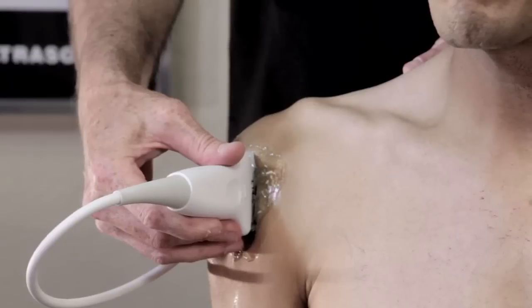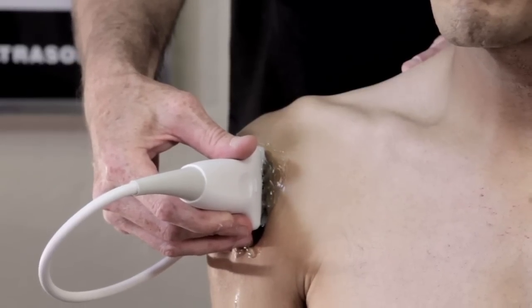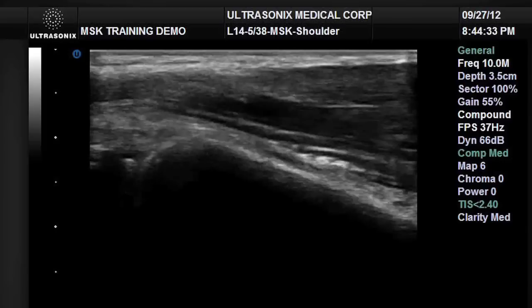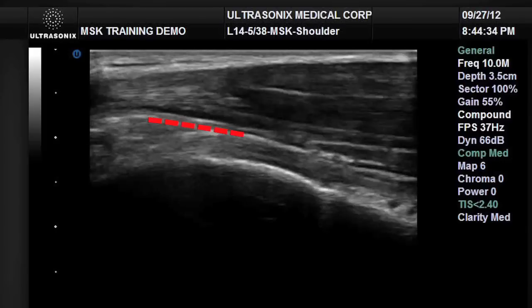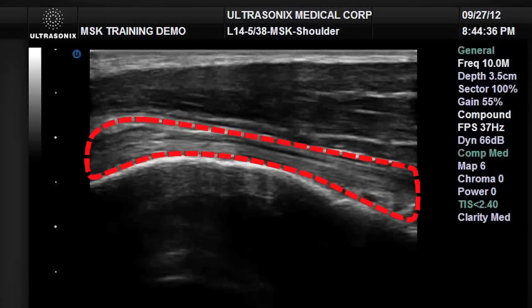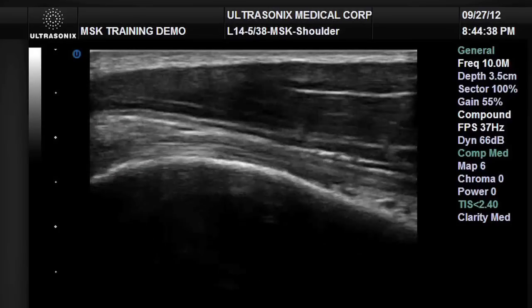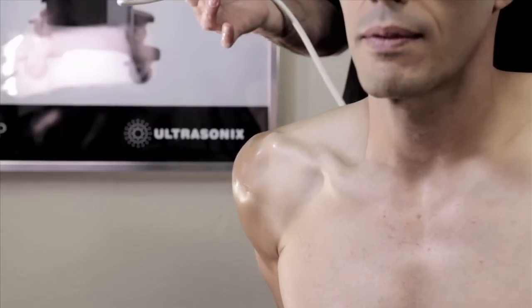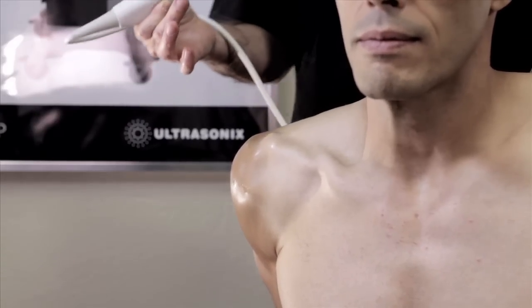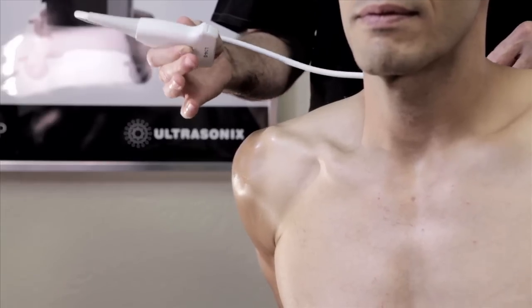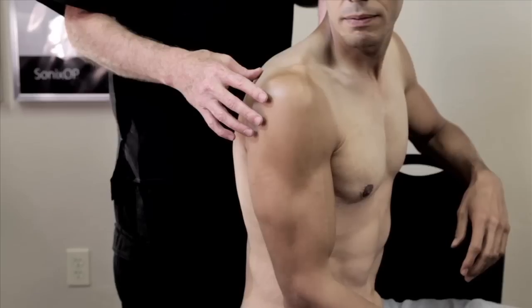Translating the probe medially very slowly, you'll notice the cortical margin of the humerus drops deeper, and the biceps tendon fibers come into view nicely following the contour of the humeral cortex, reading the image from left to right, or cephalad to caudal. Two very important images in the shoulder examination protocol are the short axis and long axis images of the supraspinatus tendon.